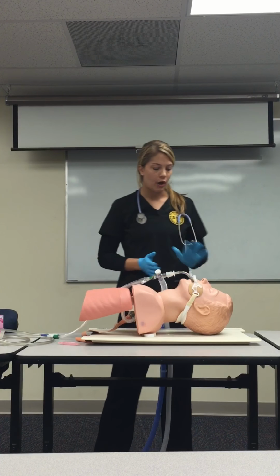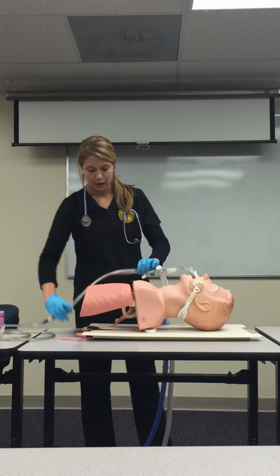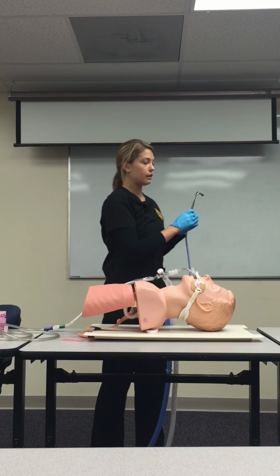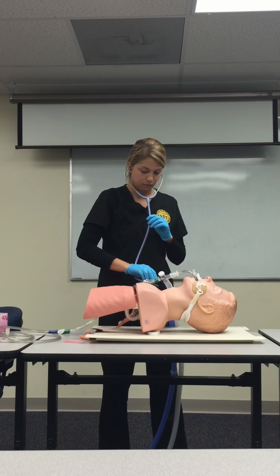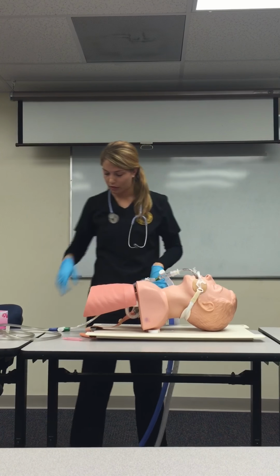I'm going to let him recover, hyperoxygenate him again for up to 30 seconds. After he recovers, I'm going to listen to his breath sounds, see if he needs to be suctioned again, see if he's all good. He sounds clear, so I think he's okay with that.